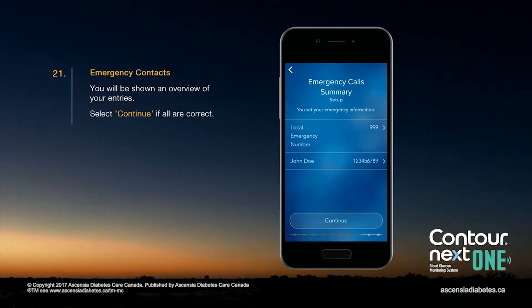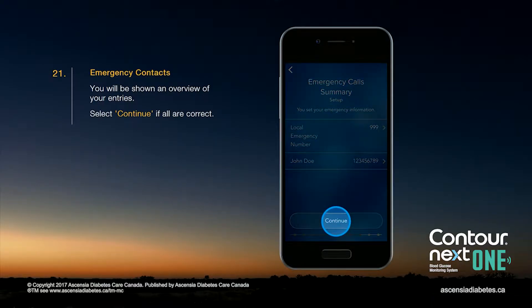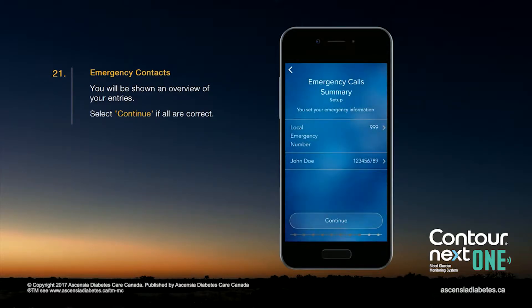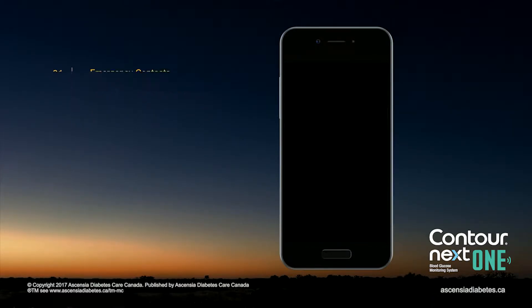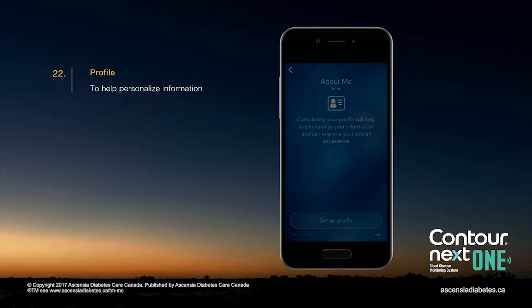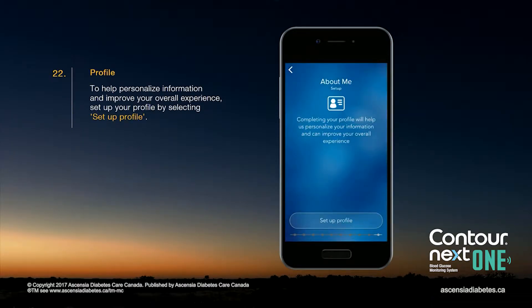You will be shown an overview of your entries. Select Continue if all are correct. To help personalize information and improve your overall experience, set up your profile by selecting Setup Profile.